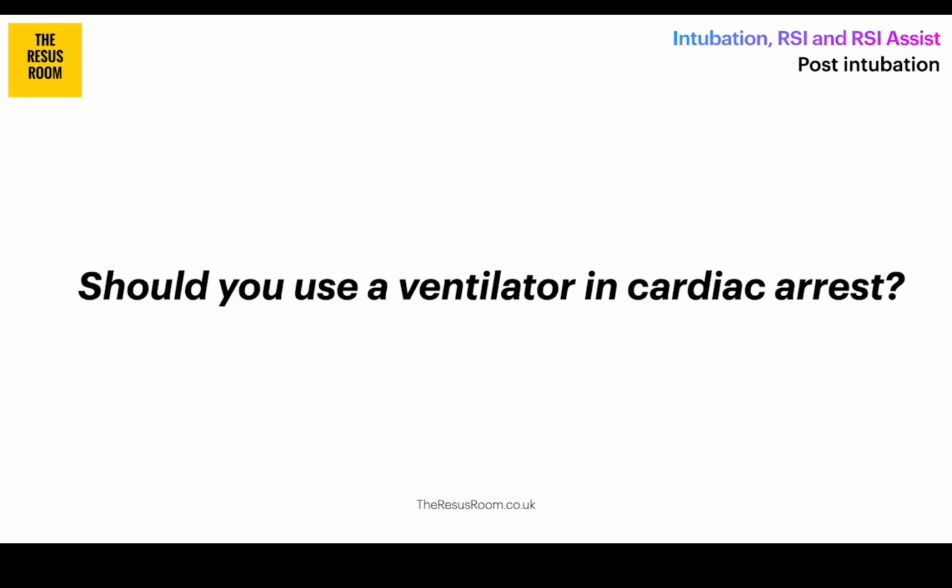So fair enough. That is a good question. Now in practice, to be honest, I do prefer to manually support ventilation in the early stages of arrest, much as I just discussed a few minutes ago, once that tube initially goes down. That's really to provide that same level of tactile feedback, but also so that we don't have to all listen to the pressure alarms going off the whole way through the first few minutes, which are quite stressful enough.